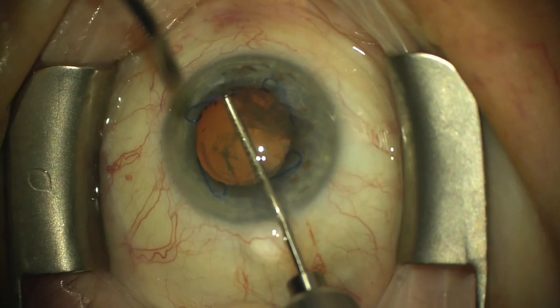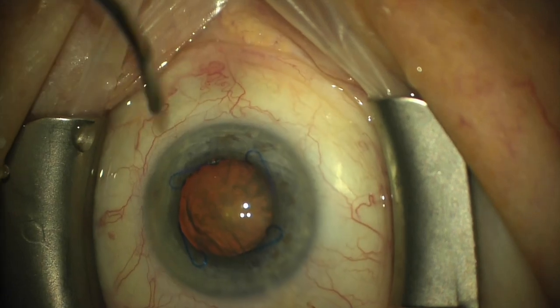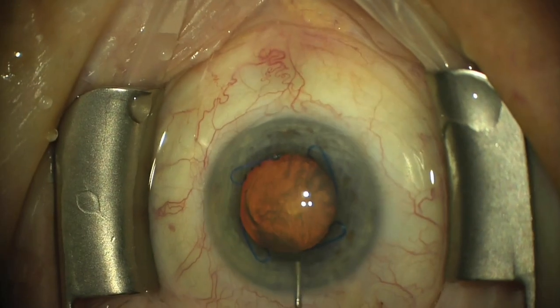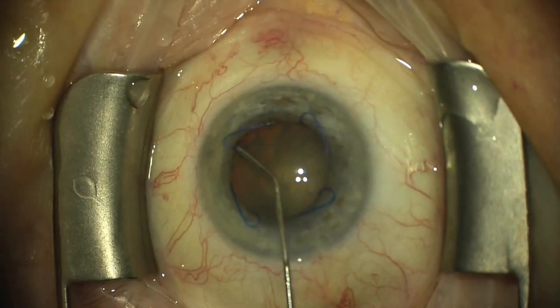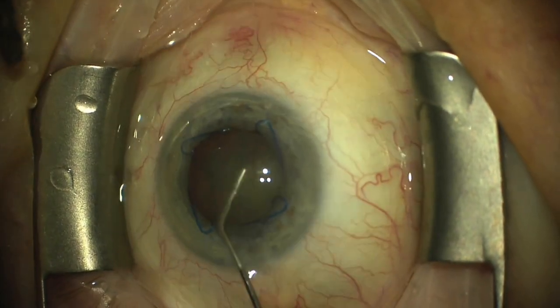We start the case by placing a pupil expander and start with the capsulorhexis, which was completed uneventfully. At the end of the capsulorhexis, it was thought that the Rhexis tissue was removed from the AC, but as you can see here, that was not the case, and it remained near the corneal incision. Evacuation of some viscoelastic prior to hydrodissection, followed by removal of the cataract, were all completed with the anterior capsule remnant remaining stuck at the endothelium of the cornea, just anterior to the clear corneal wound.